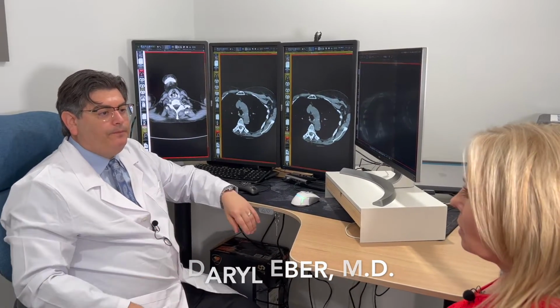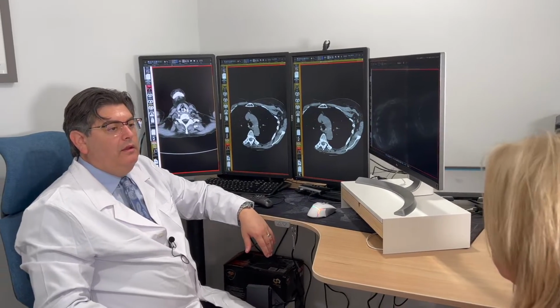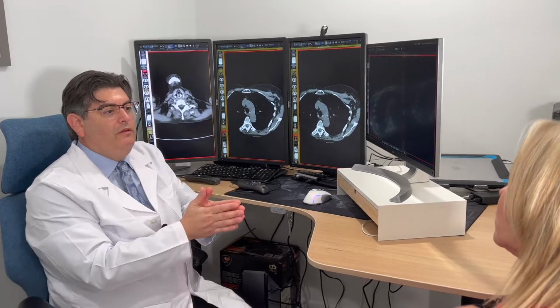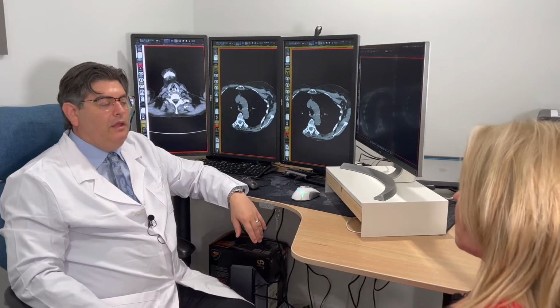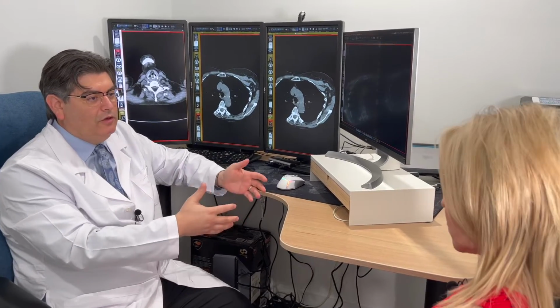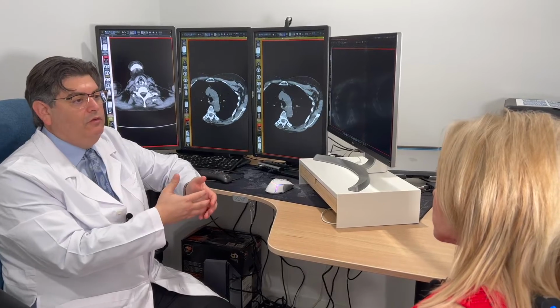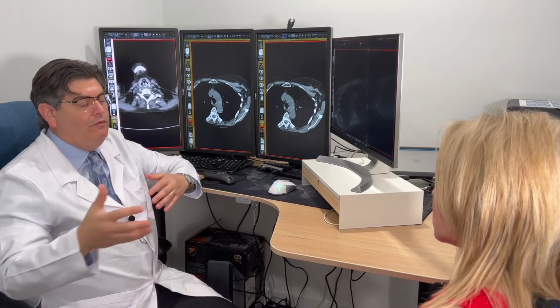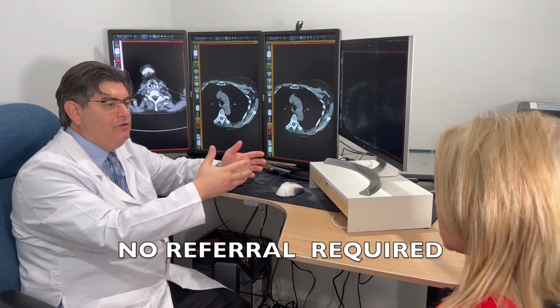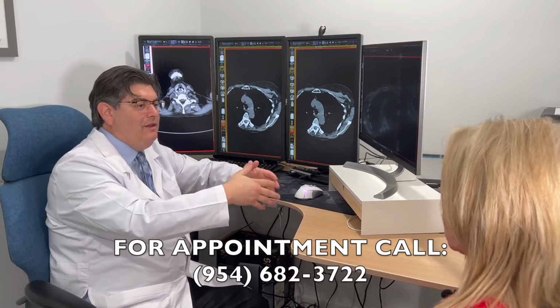And so we're trying to see how we're doing as far as health of the heart? Yeah, and then what your heart status is. In other words, this is your likelihood of having cardiac disease problems. Yeah, okay. Like if you're having existing heart disease and if you're at risk for developing a myocardial infarction, like a heart attack. Right, okay. So this is something that the cardiologists use to stratify patients to see if they need to do further workup, either through the coronary artery angiogram, traditional angiogram, or the coronary artery CT angiogram.